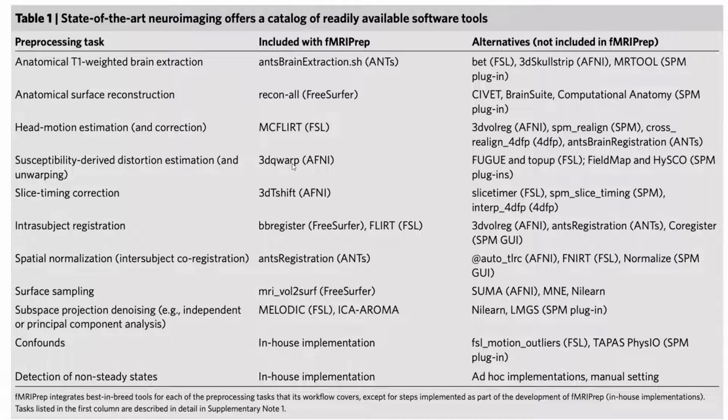So for people that have used FSL, one thing that often is problematic is the BET, sorry, for the people that have, this is a brain extraction step where it just removes the skull from the fMRI image. And that step often, I feel, requires a bit of manual intervention where your own BET doesn't really remove the whole skull, or it removes too much.